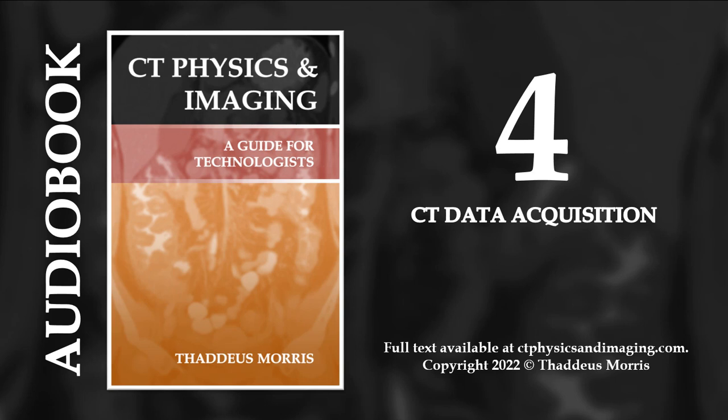When the scan is initiated, the tube and the detectors rotate around the patient and acquire the first section of data. Next, the patient table slides forward and the next section is acquired. Axial scanning is not a continuous exposure. The X-ray exposure and the data collection process pauses while the table moves the patient to the next position.